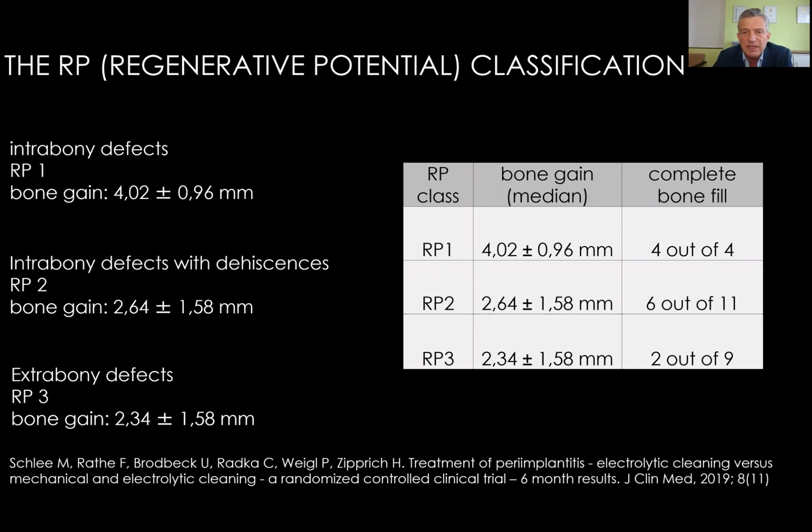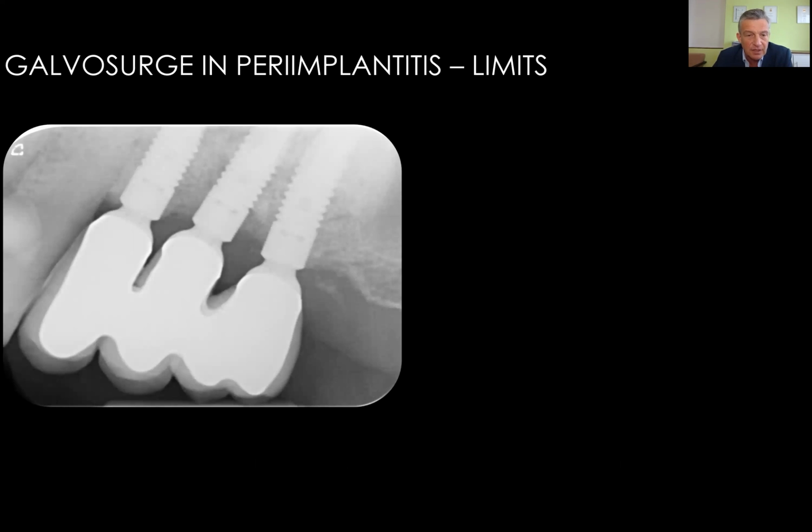But this was the most interesting result to me. How many implants reintegrated completely? 4 out of 4 in RP1, 6 out of 11 in RP2, and 2 out of 9 in RP3. Again, this is a hint that not every implant should be treated.